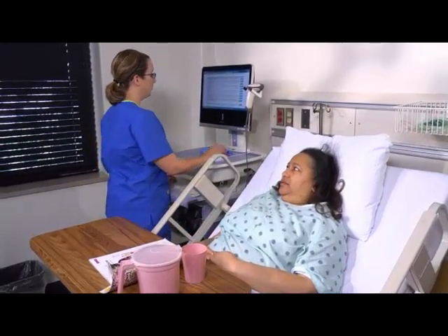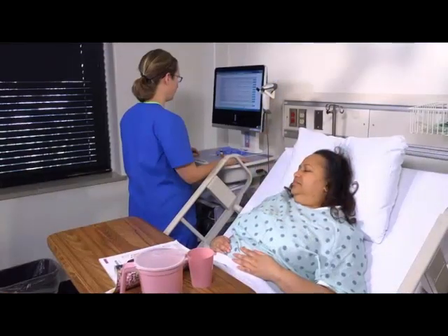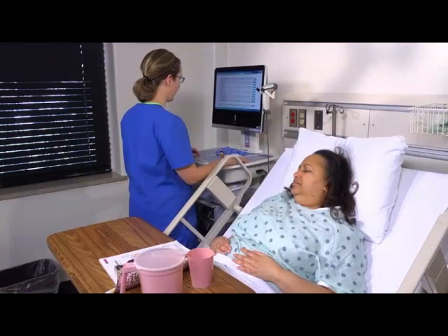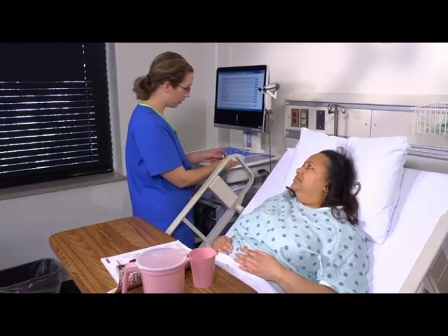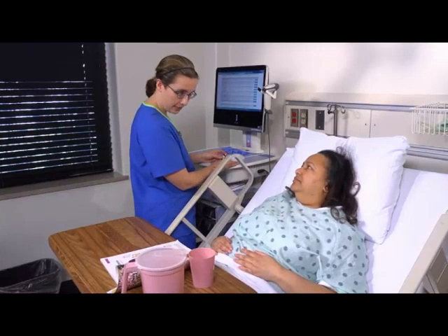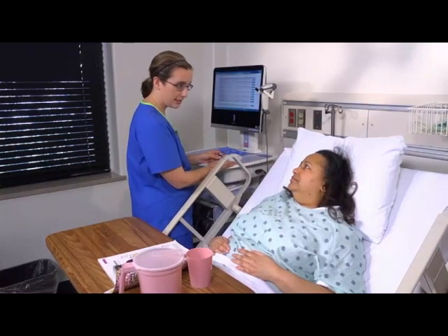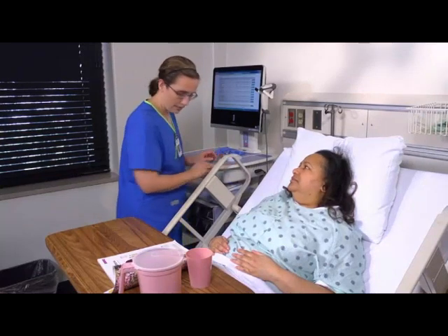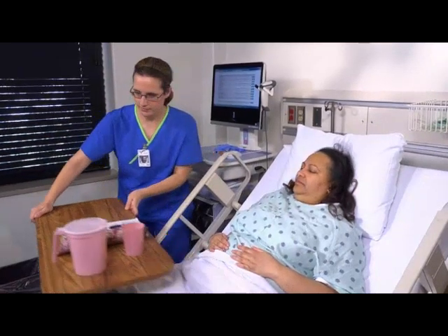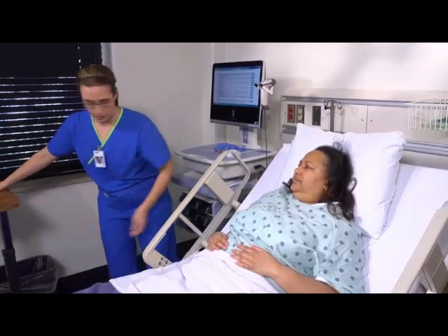Then access the electronic MAR again at the bedside, and once again compare the medication label with the MAR — this is your third check. Tell the patient why she's getting the medication, what it does, and what its potential side effects are. Encourage her to ask questions, and caution her that the injection may cause a slight stinging or burning sensation.